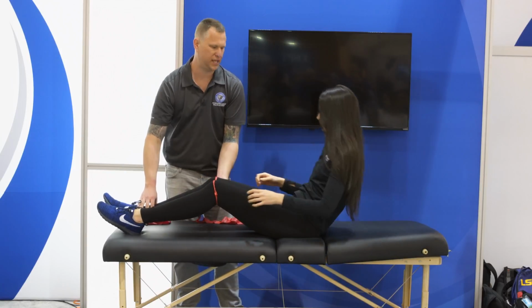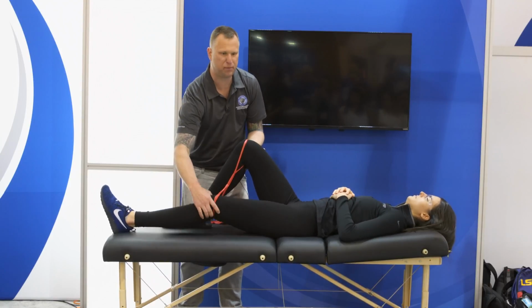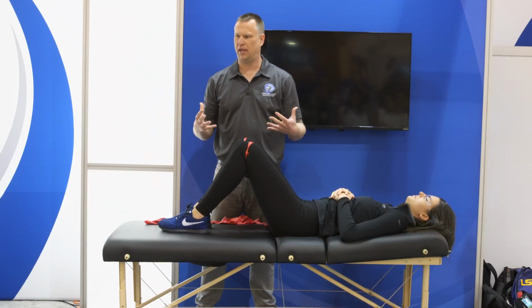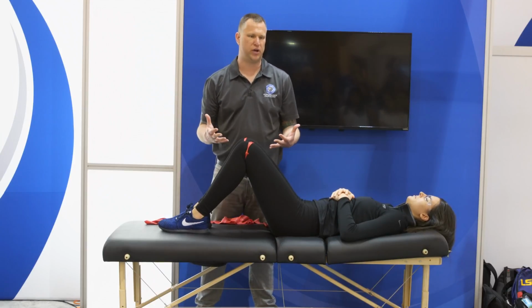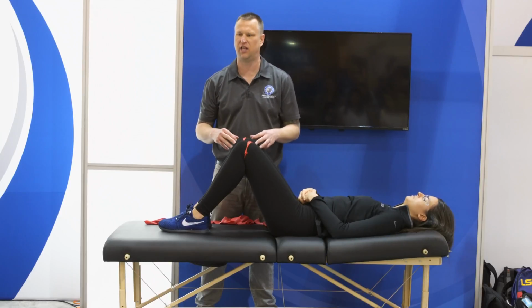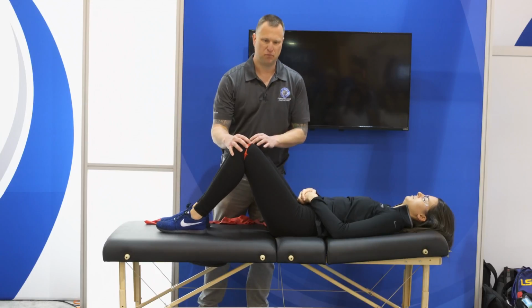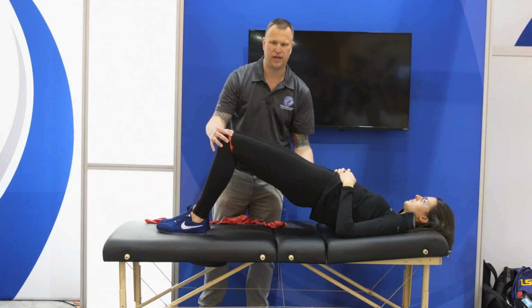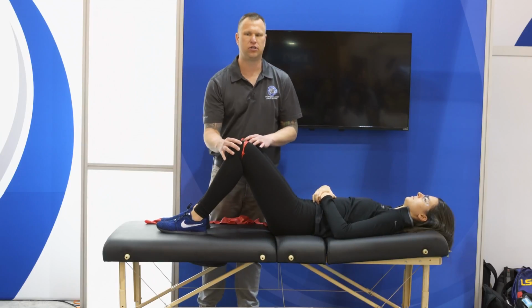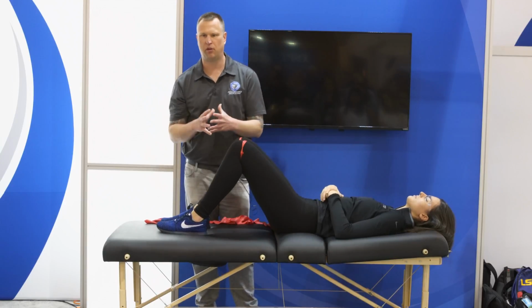And then I'm gonna go ahead and take our patient, we'll stay supine, but into a bridge position here for a moment with both sides. So we can now start introducing multi-plane exercises with things as functional as a bridge, which really is kind of a basis of pushing and pulling, getting up from a chair, functional activities. So again, early phase functional activities. So we could do a bridge. Most of us are familiar with that. So I cue her into a bridge and then back down. But by putting that loop there, I can cue her to do a little bit of a push out, stimulating the glute med, creating, again, multi-plane exercises.